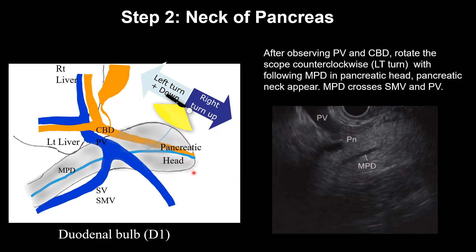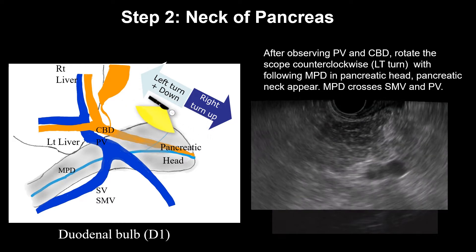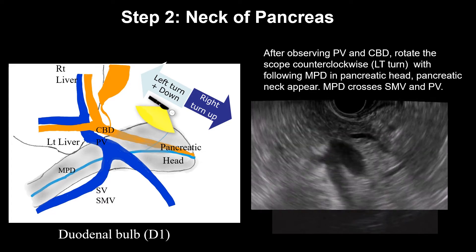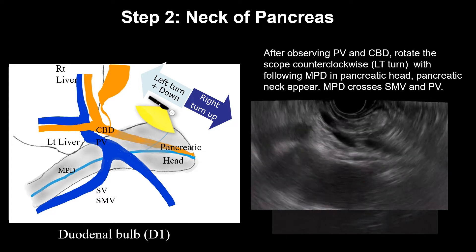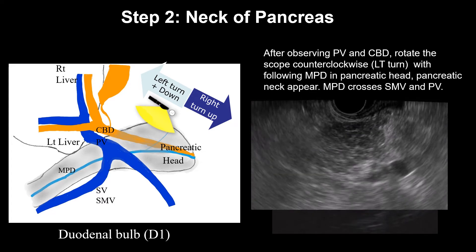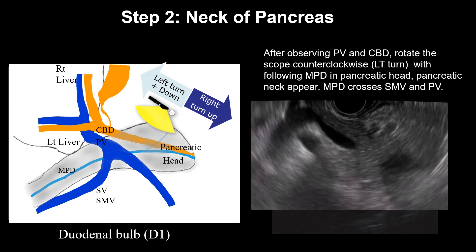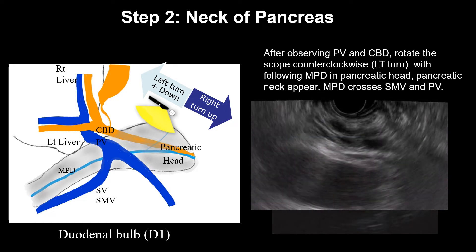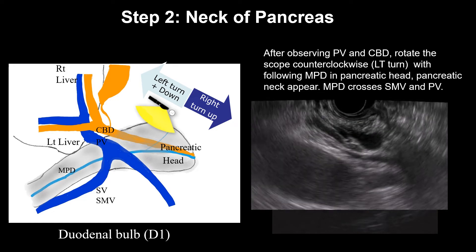After observing the portal vein and CBD, rotate the scope to the left. Following the main pancreatic duct, we can see the pancreatic neck area, MPD, portal confluence, SMV, and portal vein.